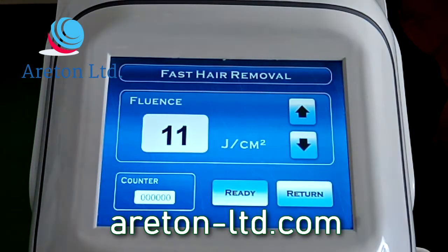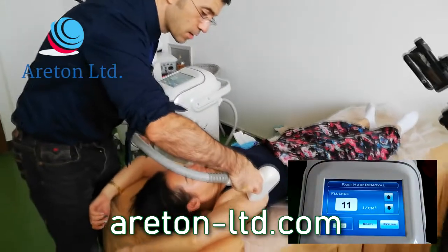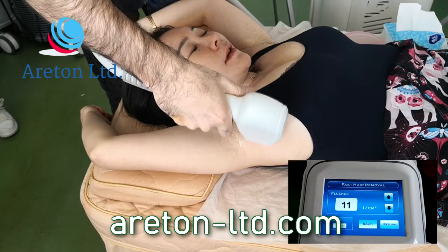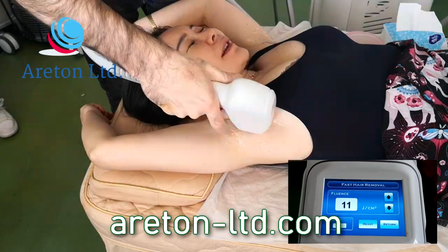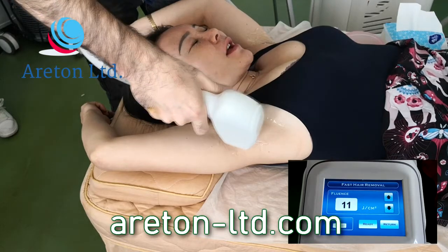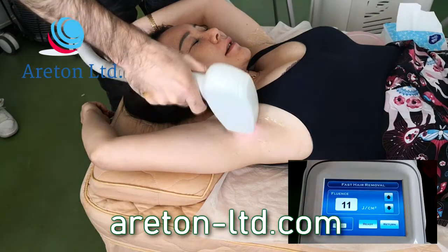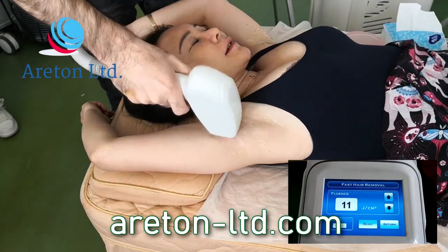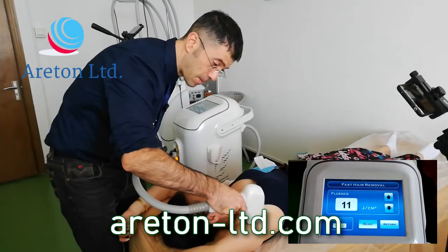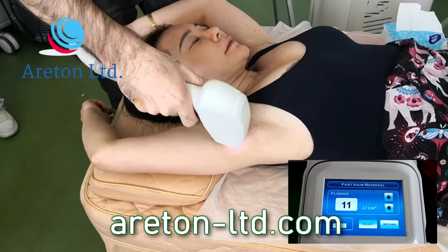So I'm going to start it. Yes, there we are. So I'm going to start it right now. It's very easy. So I've got to move quite quickly, because otherwise it's too painful. And it feels as if you've got needles into your skin.